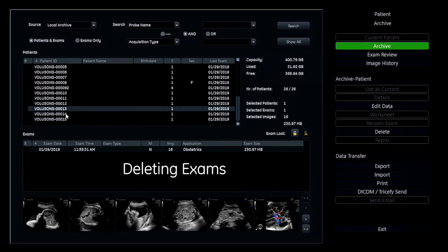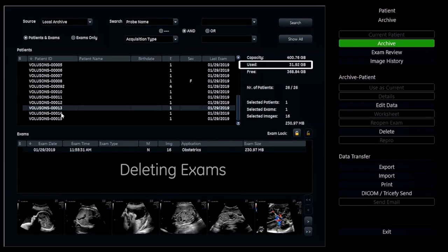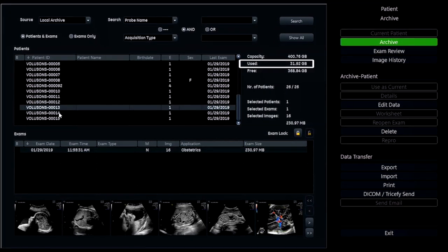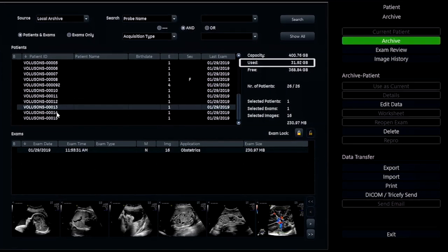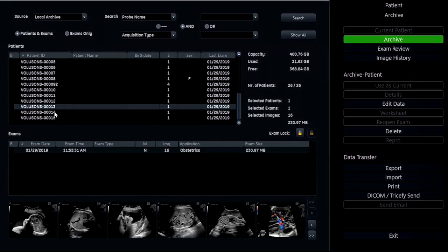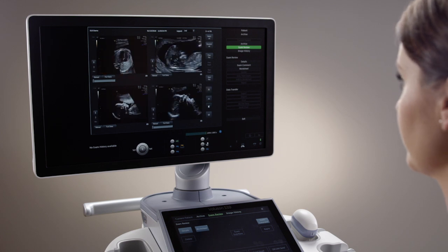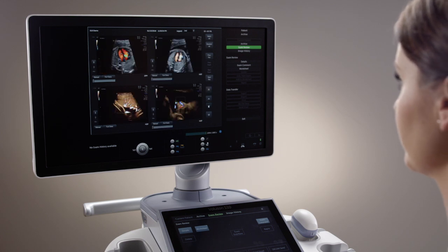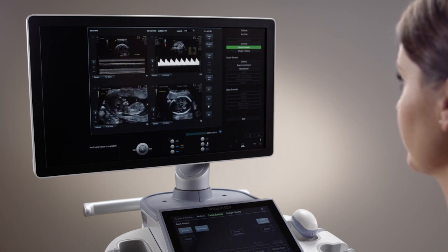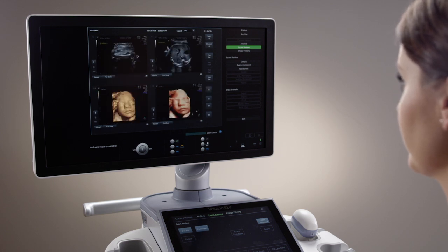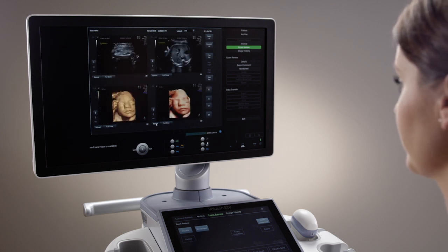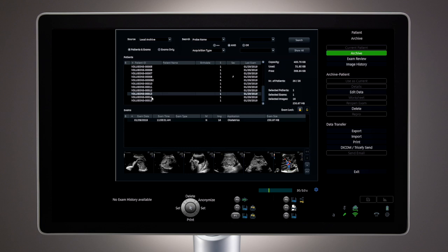As the hard drive fills, exams should be periodically deleted to help promote maximum system performance. If the system begins to perform slowly, it may indicate the need to remove some data from the hard drive. A good best practice is to keep the archive storage to approximately 50% full.